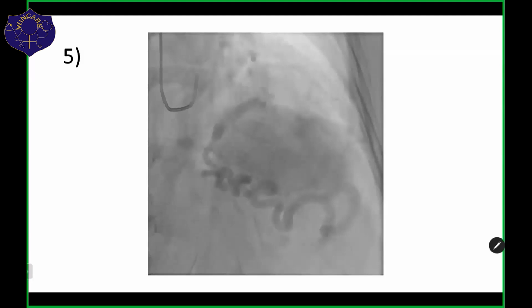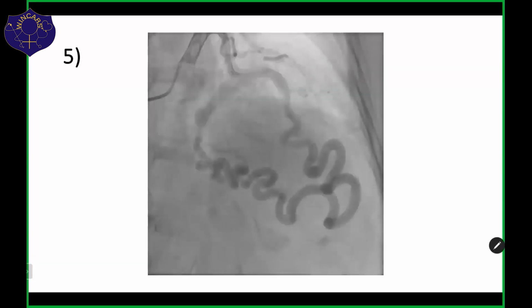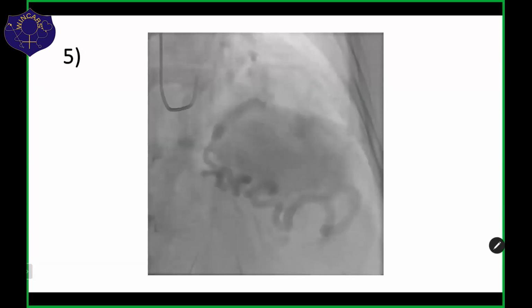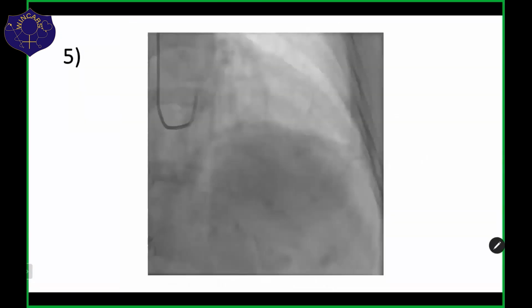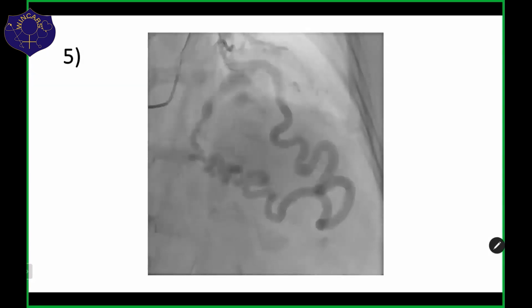There is a possibility that the patient may become symptomatic later on. Yes, ma'am, we should know how to deal with it. Thank you, everyone. This connection is so small. Would it cause steal? It is so tortuous, we don't know. It may not be causing coronary steal, ma'am. Right, right.